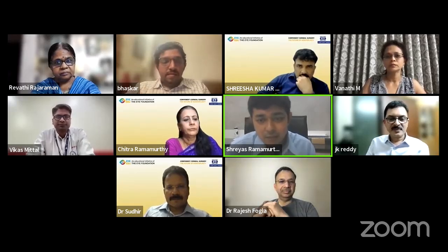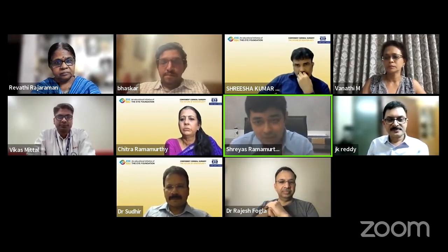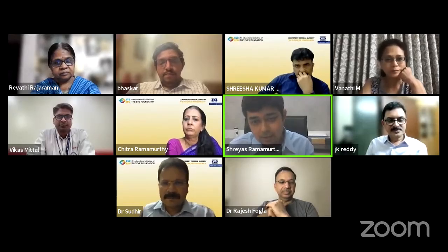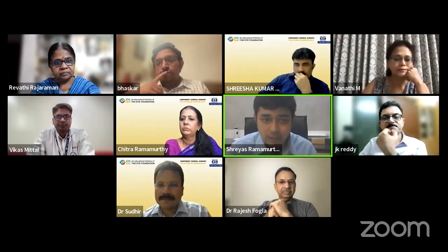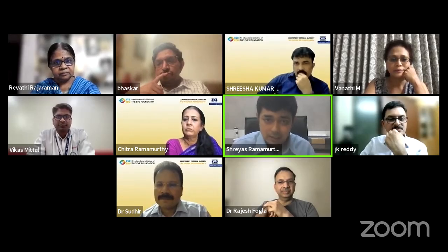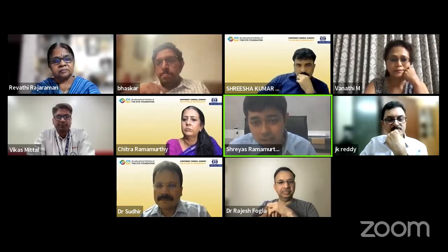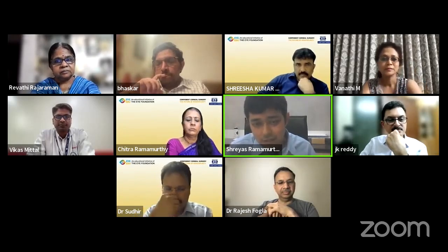Another potential area, and I'll direct this question to Vanati madam, where we would prefer manual over big bubble is in the case of active infections when we are trying to do a therapeutic DALK, especially Acanthamoeba and certain fungal infections which have still not reached the DM. What would be your suggestions on that, madam? How do we achieve a DALK in those cases with active corneal infection?